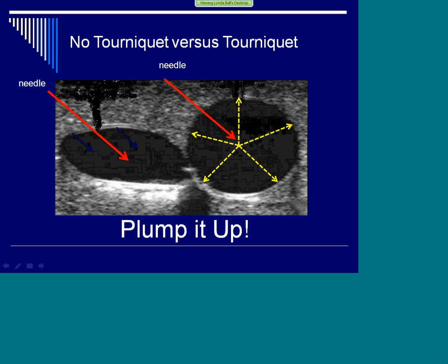Now, when we look at the other picture, there is no extra blood coming in and plumping up the walls. Actually, when you put the needle in, the pressure exerted on the wall, because there's not a lot of resistance there, comes inward this way, and it actually pushes down, and now your vessel's not round anymore, but it's becoming oblong. And when I'm halfway in, I'm pretty close to the back wall. If I use too steep an angle when I come in, I will be at the back wall, and I could potentially be through the back wall. So this is the back of the wall.